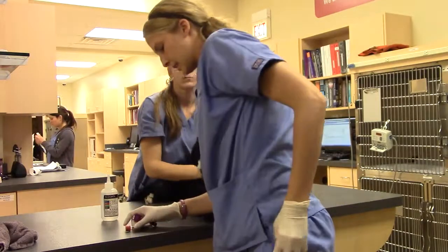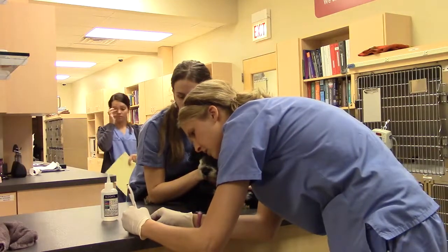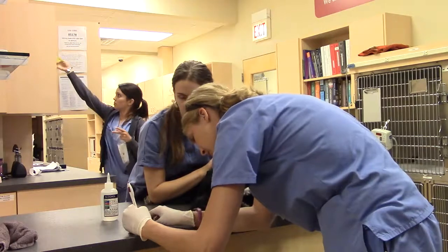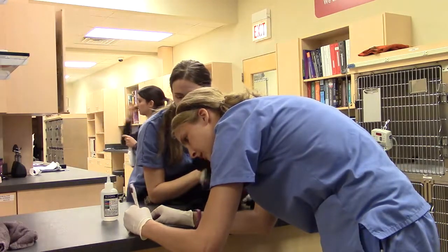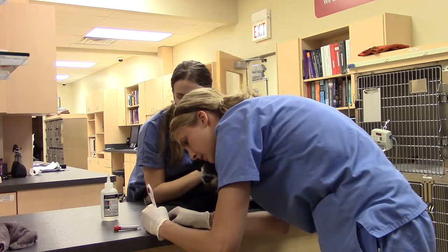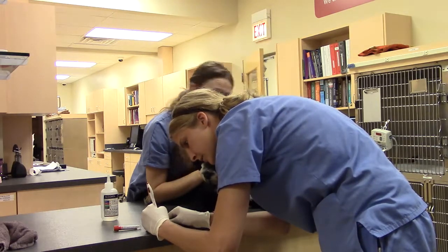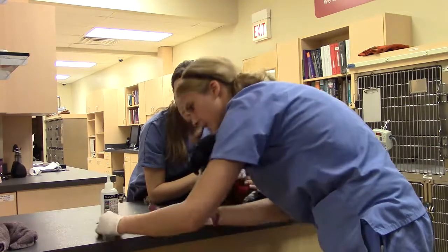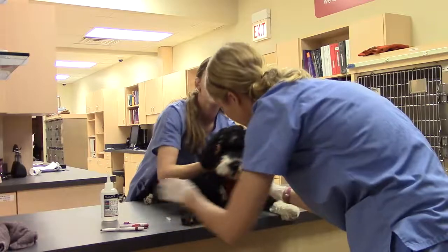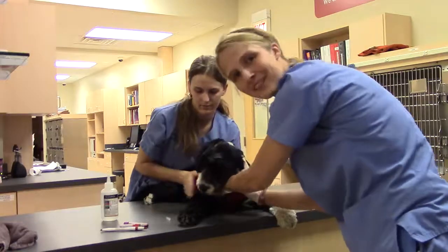And then we're going to label this with her name and the date for today — 6/7/17. Now that I have those both labeled, I'm going to go ahead and check her neck, make sure everything looks good. Which it does. And then we're all set.